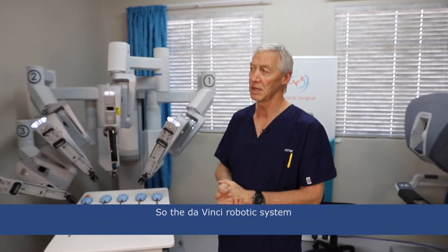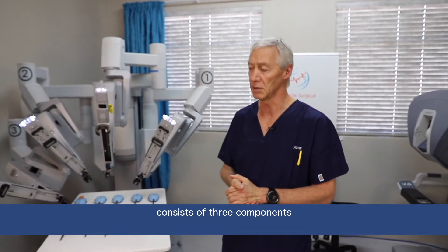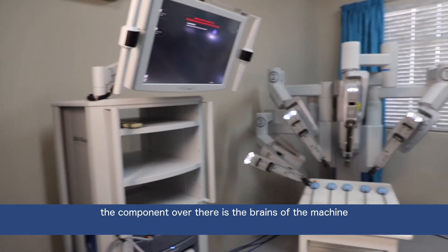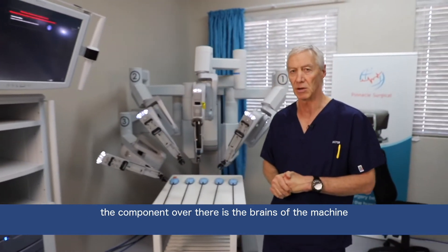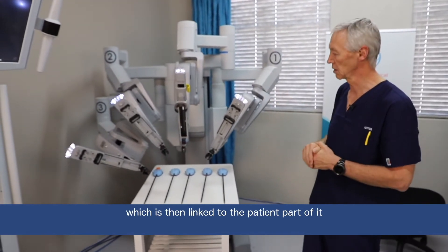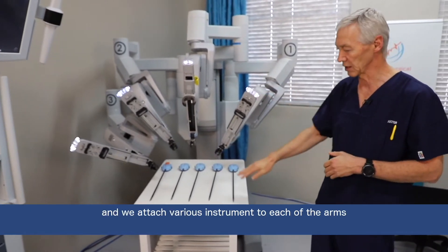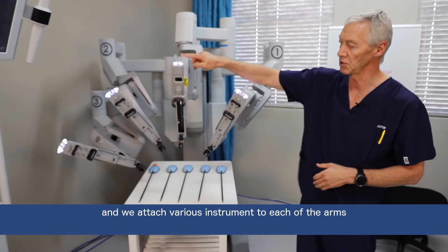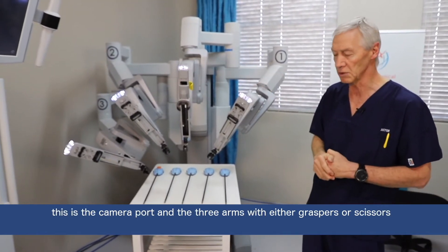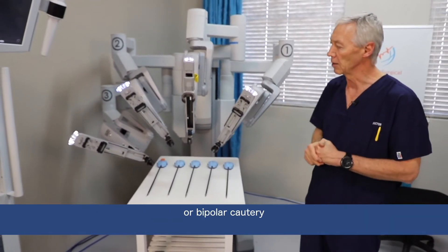The da Vinci robotic system, which we are using now, consists of three components. The component over there is the brains of the machine — the computer aspect — which then links to the patient cart. This is the cart that hangs over the patient, and we attach various instruments to each of the arms. This is the camera port, and then the three arms with either graspers, scissors, or other instruments.